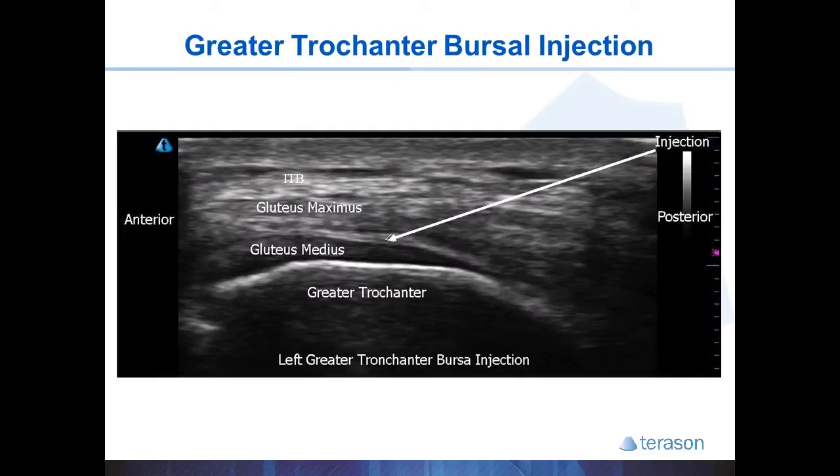Here is an example of the procedure showing the transverse IT band just above the gluteus maximus, and the gluteus medius tendon wrapping down to attach onto the greater trochanter. The plane we are looking to inject into is right in between these two muscles and tendons.